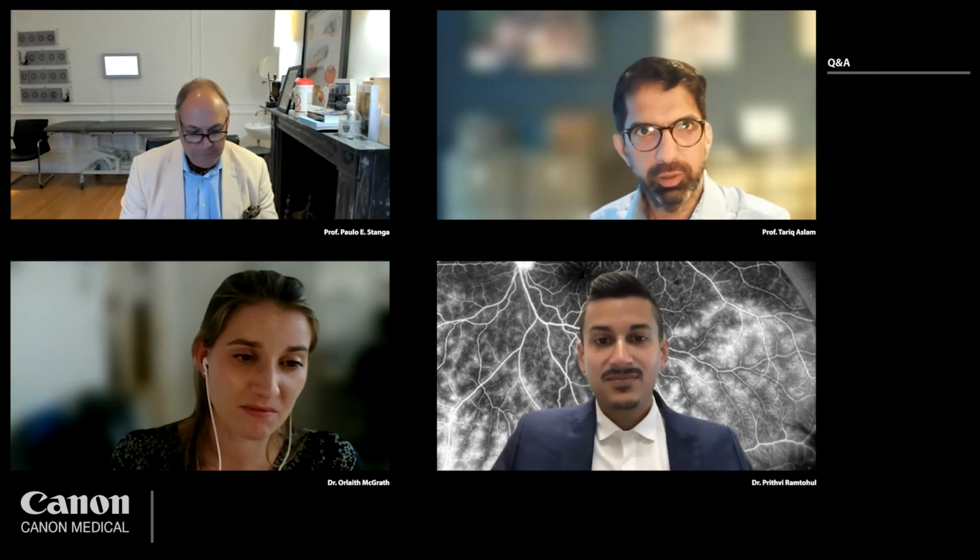Well, I think that we can reduce the amount of fluorescein angiograms we do quite a lot. I think that the OCT, especially wide field OCT, is really beautiful. I think there can still be improvements to other plexus, like the deep capillary plexus, for example. Sometimes some of the fine detail of that can be lost. But every year when I give these talks, there are more and more indications for it.